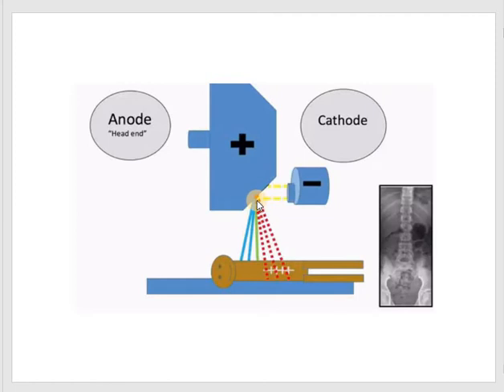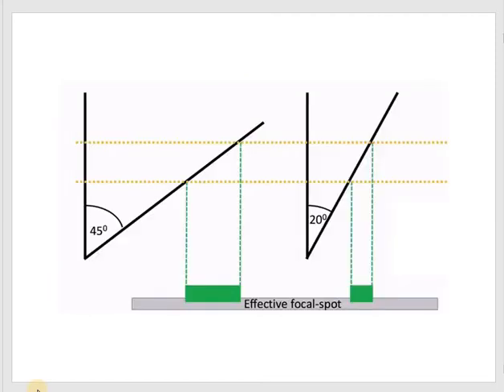So if you have a tube to patient distance that is shorter, you can only make a small usage of this central beam. But if the source or tube to patient distance is higher, you can make bigger use of the central X-ray, that is 100% in our example. Let's look deeper into the definition of anode target, focal spot, effective focal spot, and anode angle.